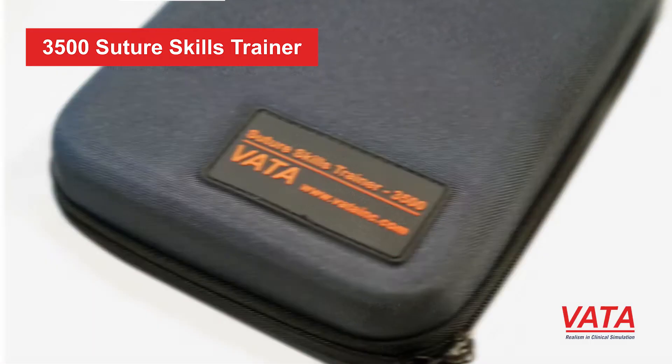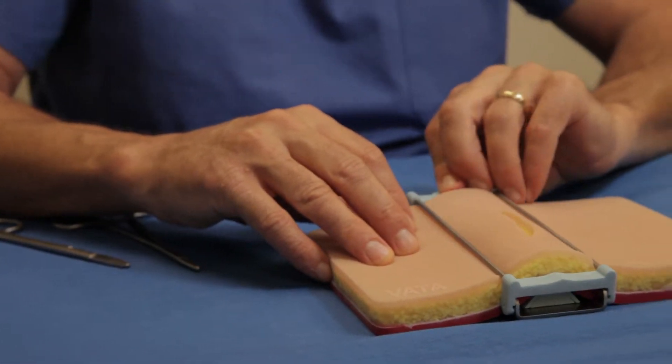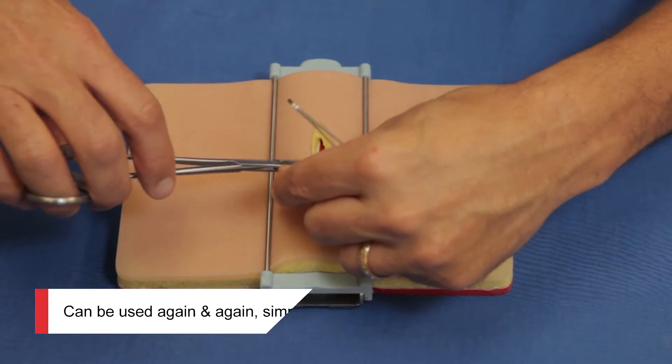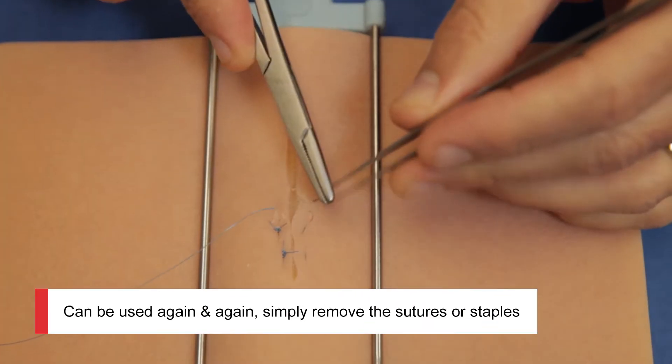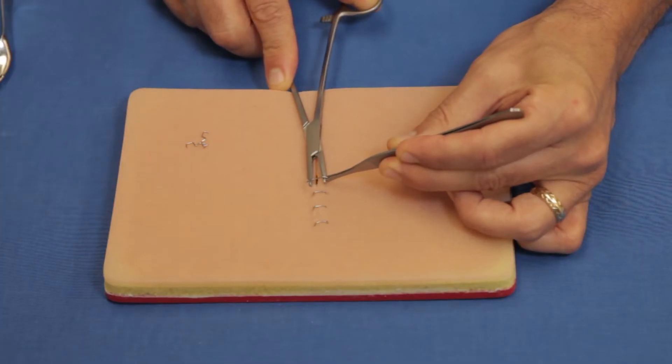This suture skills trainer by VATA, the 3500, is the complete solution for practicing suturing. It's incredibly lifelike and really feels like you're operating and suturing on normal tissue. It's compact and has everything that you're going to need for suturing. Take it with you wherever you go for practicing.